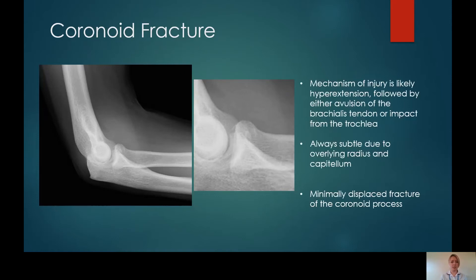Coronoid fractures are frequently missed elbow injuries, because of the overlying bony structures. This is an example of the importance of forcing your eye around the bony contours of each bone. If you look down the distal humerus, you won't see anything. The round radial head — you won't see anything. Then force your eye around the contours of that ulna, and then you should be able to see that very subtle disruption of the coronoid. They are always subtle, so always make sure that you scrutinise this part of the X-ray on every elbow.